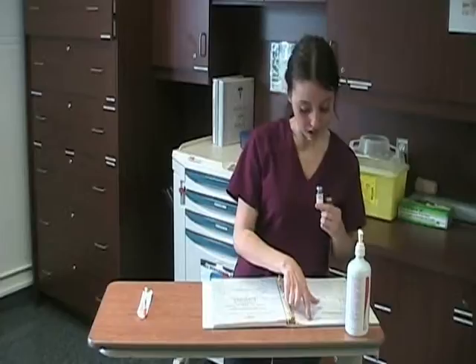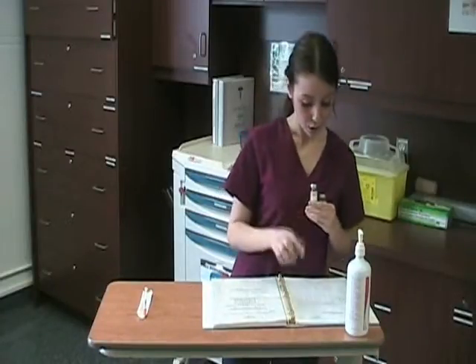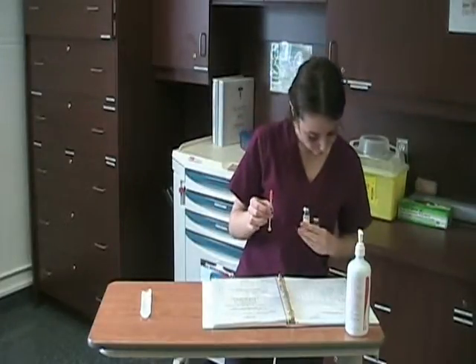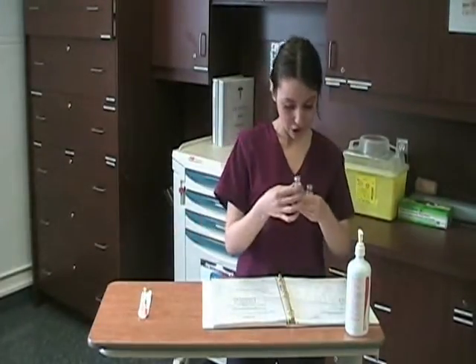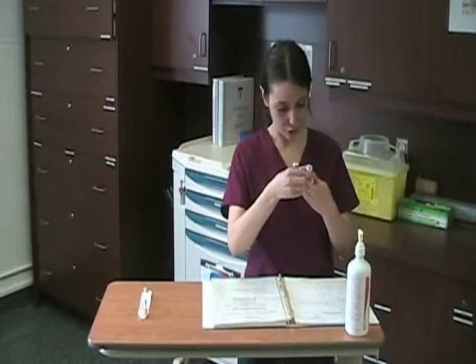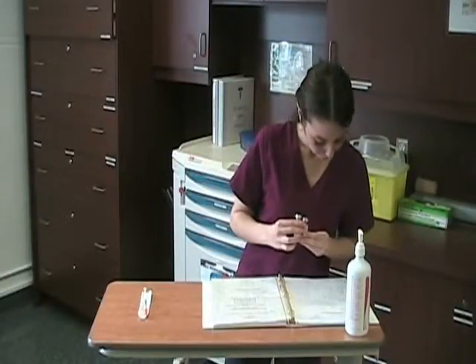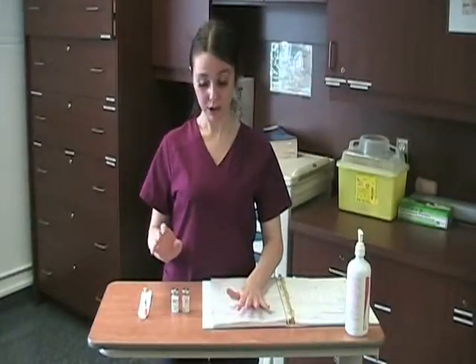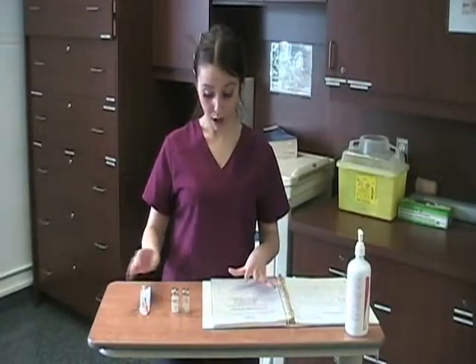Before putting the materials away, we're going to do our five rights one more time: the right patient, the right dose, the right time, the right medication — Humulin N and Humulin R — and the right route. Once we've confirmed our five rights, this is ready to be administered to our patient. We clean up our area, put our materials away, and the technique is finished. Thank you very much.